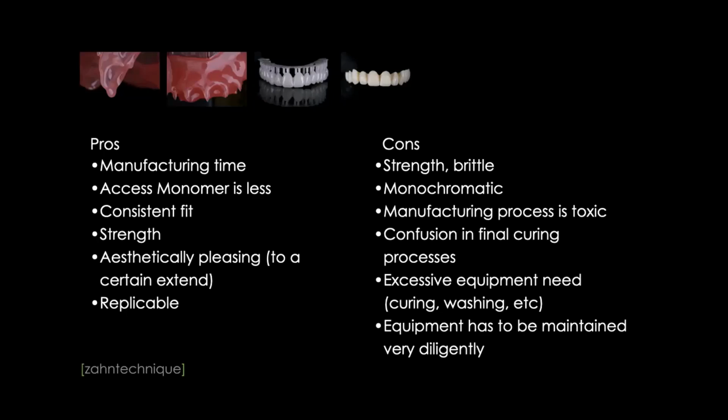To the pros, you said aesthetically pleasing to a certain extent. So what is that extent? When we look especially into dentures, most of these pink resins in the past were pretty translucent, and you could see the teeth through. The denture teeth were glued in or processed in, and you could see the necks. That looked pretty bad, to be very clear. Nowadays, we have higher opacity resins, which already makes for better aesthetics. So yes, we are having better aesthetics in these resins, right?